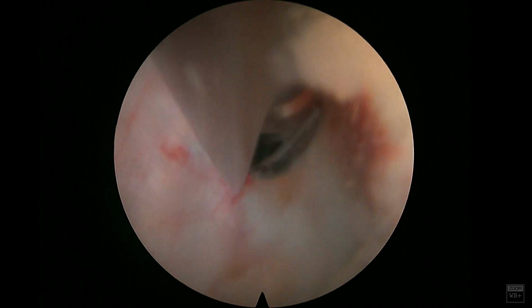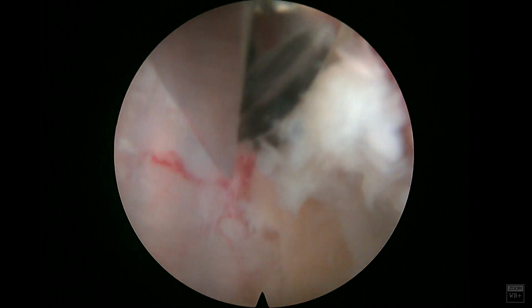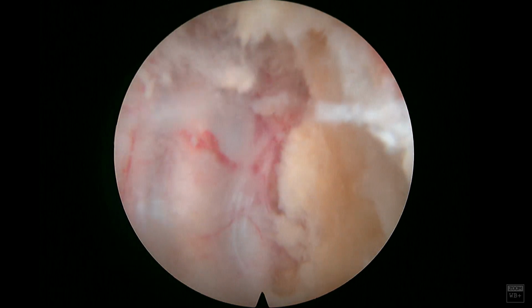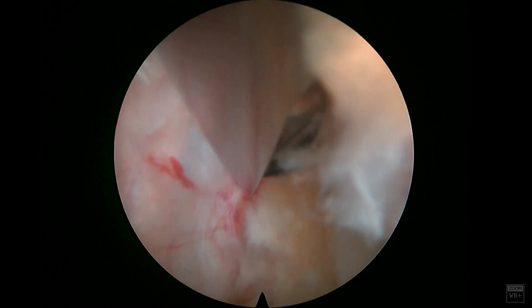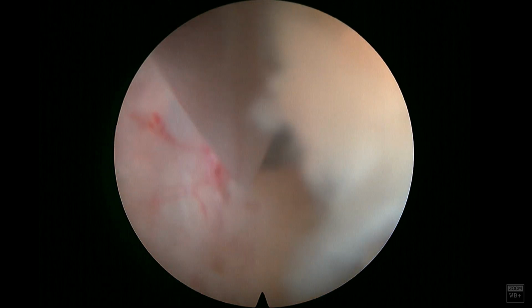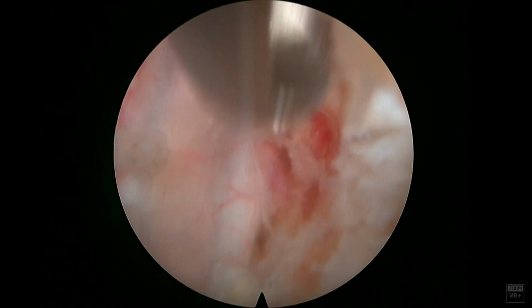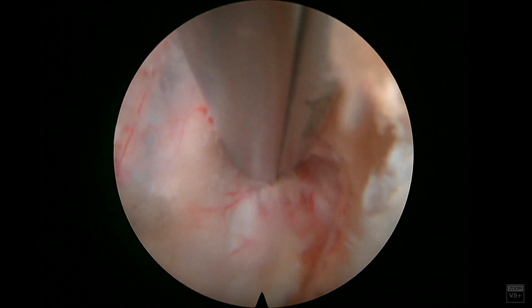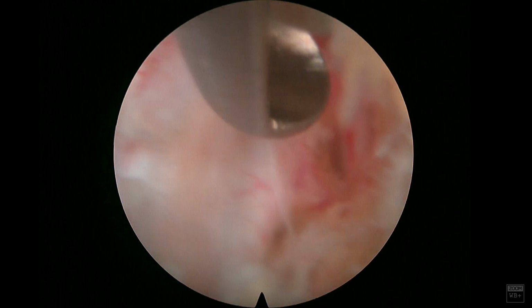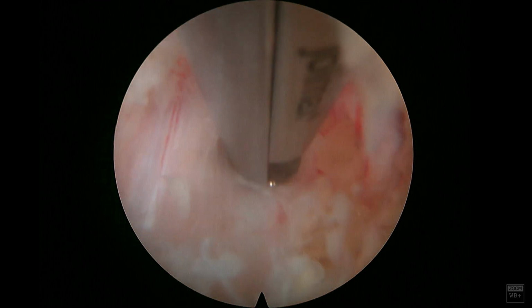A lot of times I'm also pausing between using the burr to allow the bone dust to leave the tube. Again, I don't want to use the burr when my view is obscured, because that's really where you can get into a lot of trouble. I really take my time with the side cutting burr to decompress the lateral recess. I'm using the Kerrison here to retract the dura a little bit, as well as take some bites so I can continue the decompression laterally.